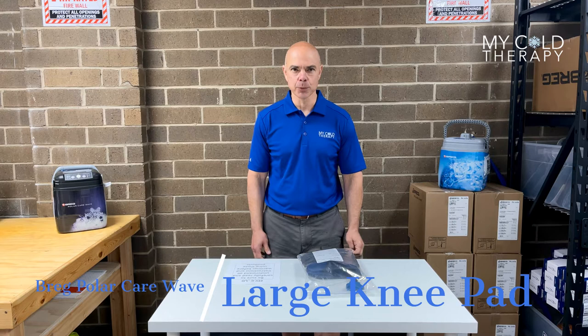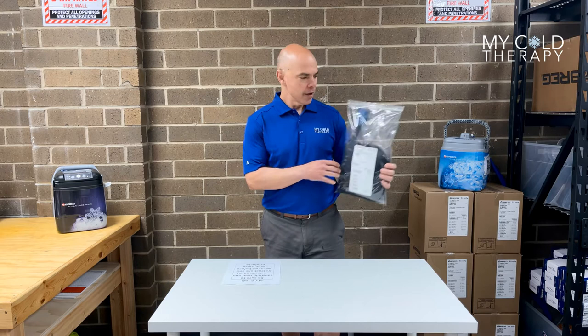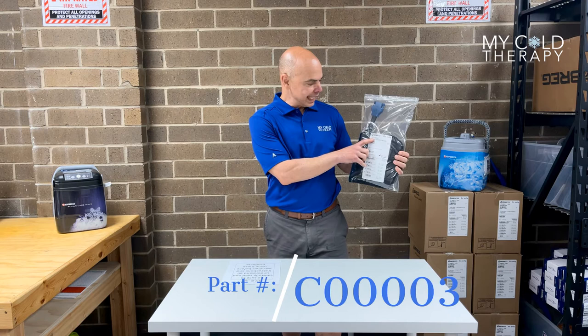Hi, my name is Steve from My Cold Therapy, and today we're going to talk about the Breg Polar Care Wave Pads. In this particular case, we're going to talk about the large knee pad. This is what it's going to look like when you get it in the mail. First thing you want to do is check the part number and make sure you have the right pad. This is C00003 for the large knee.